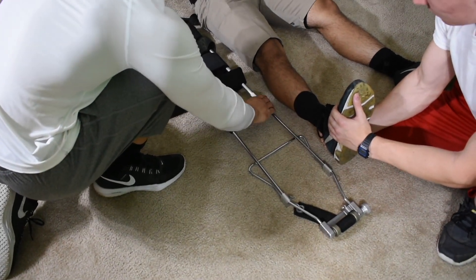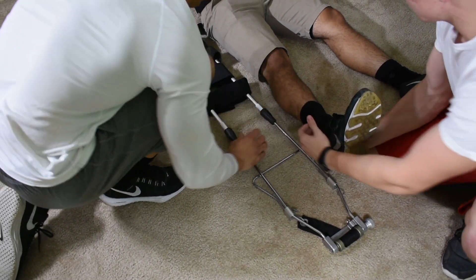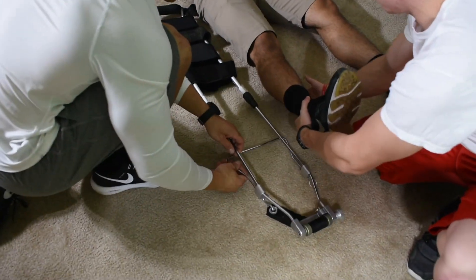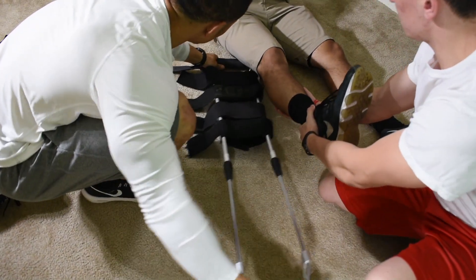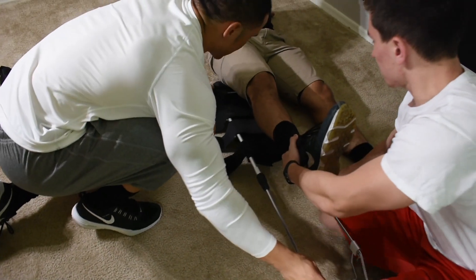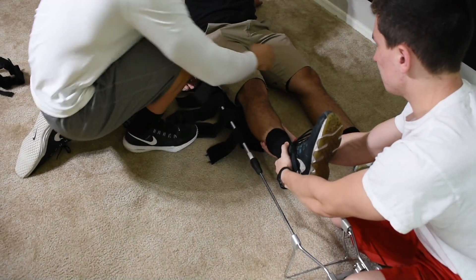Now just tighten — righty-tighty. I'm going to have my partner slightly lift up; it's going to open this here, and then I'm going to drive this right under the leg. There we go. Keep applying traction.